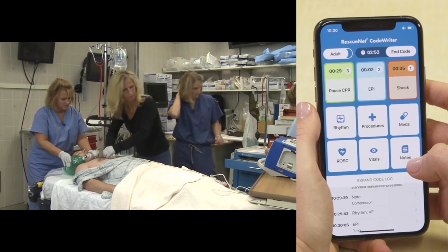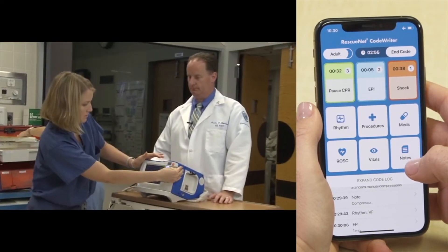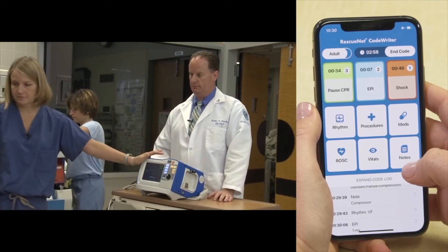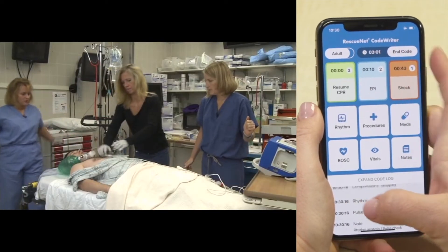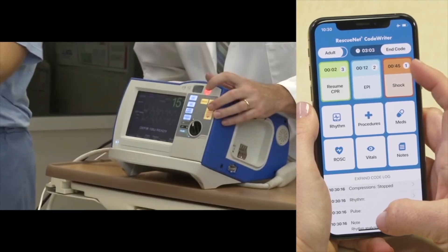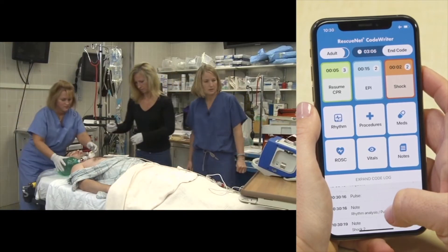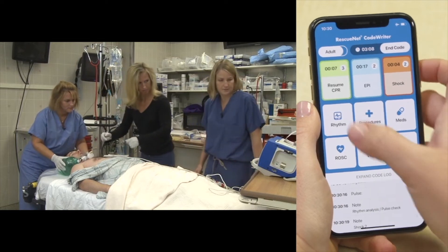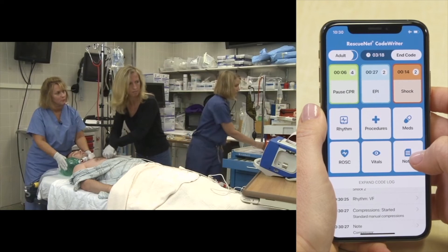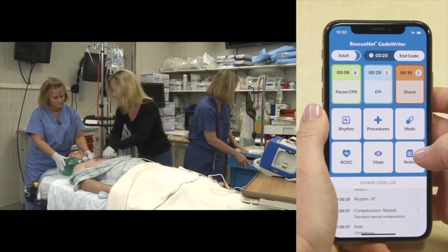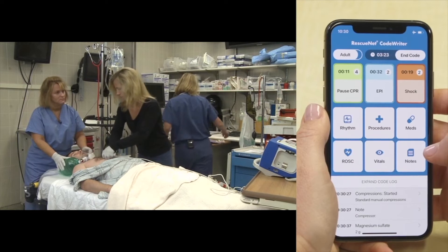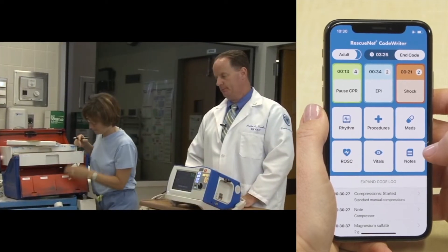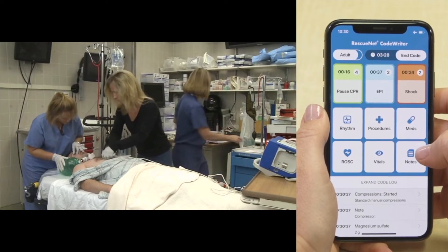The second shock is delivered. The rhythm remains V-fib. CPR continues and 300 mg of amiodarone is ordered. Labs are requested including ABGs and electrolytes. Magnesium is administered. The team monitors pupil reactivity — pupils remain unreactive and very dilated. Amiodarone is confirmed in and fluids are wide open with approximately one liter of saline given so far.